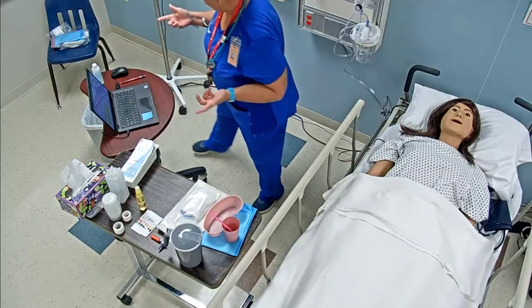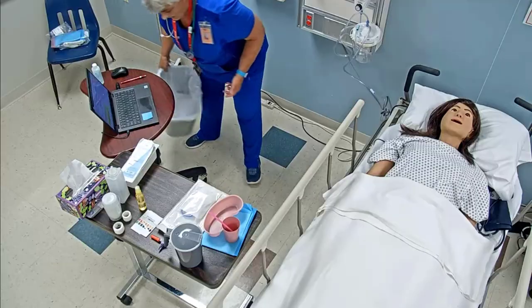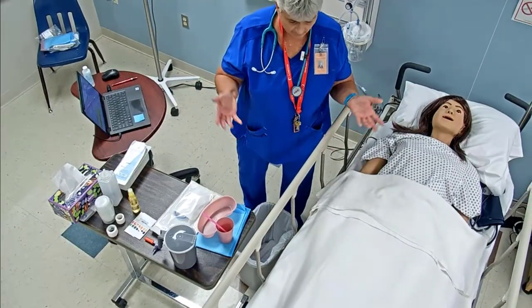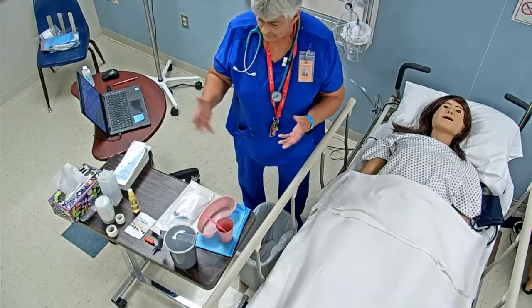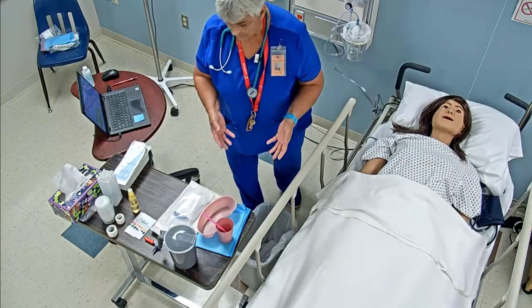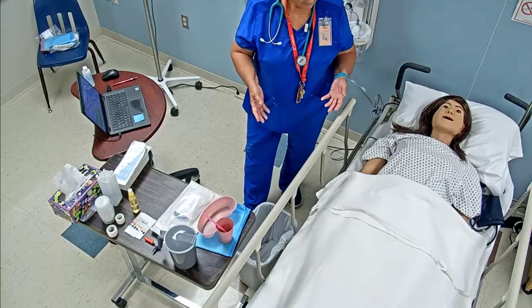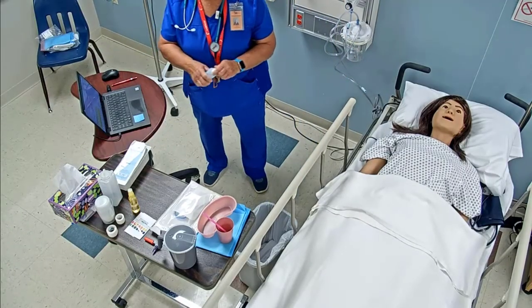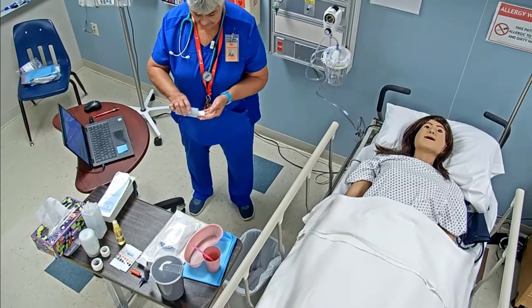And so I'm going to go ahead and get my trash over here, and I've got a biohazardous bag, putting any kind of supplies in there and disposing of it per hospital policy and procedure. Because I touched the trash, I'm going to go ahead and wash my hands.